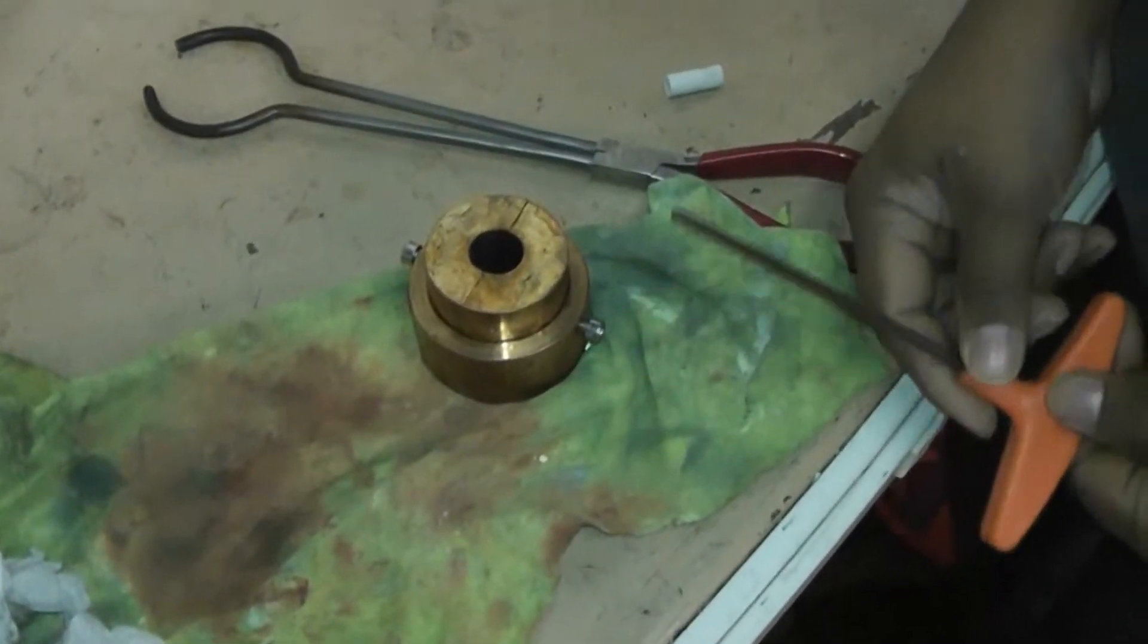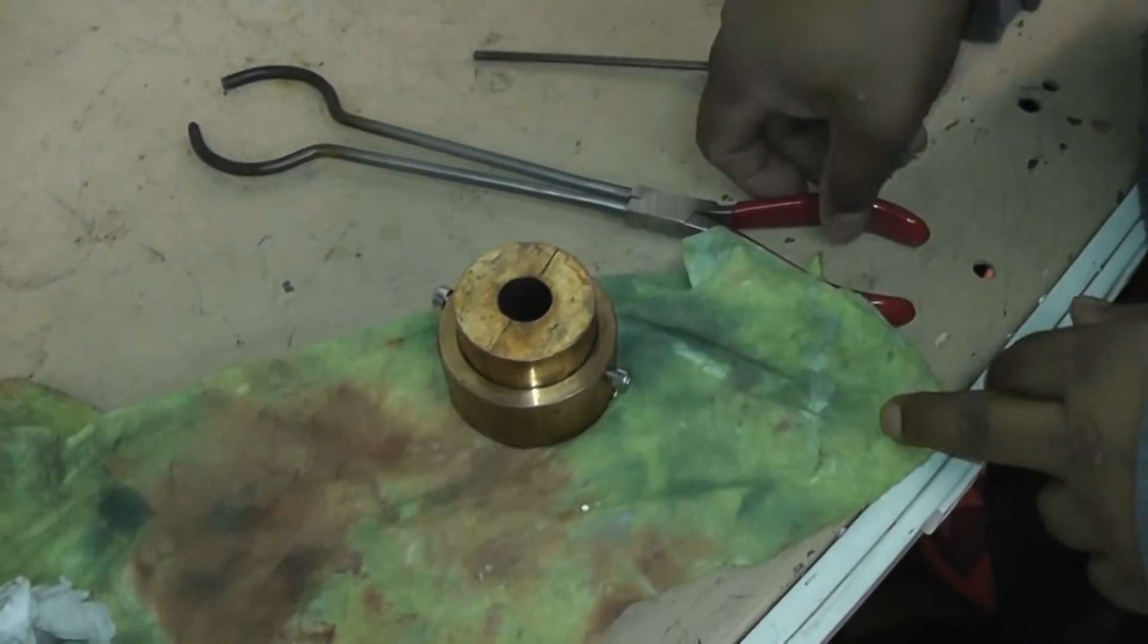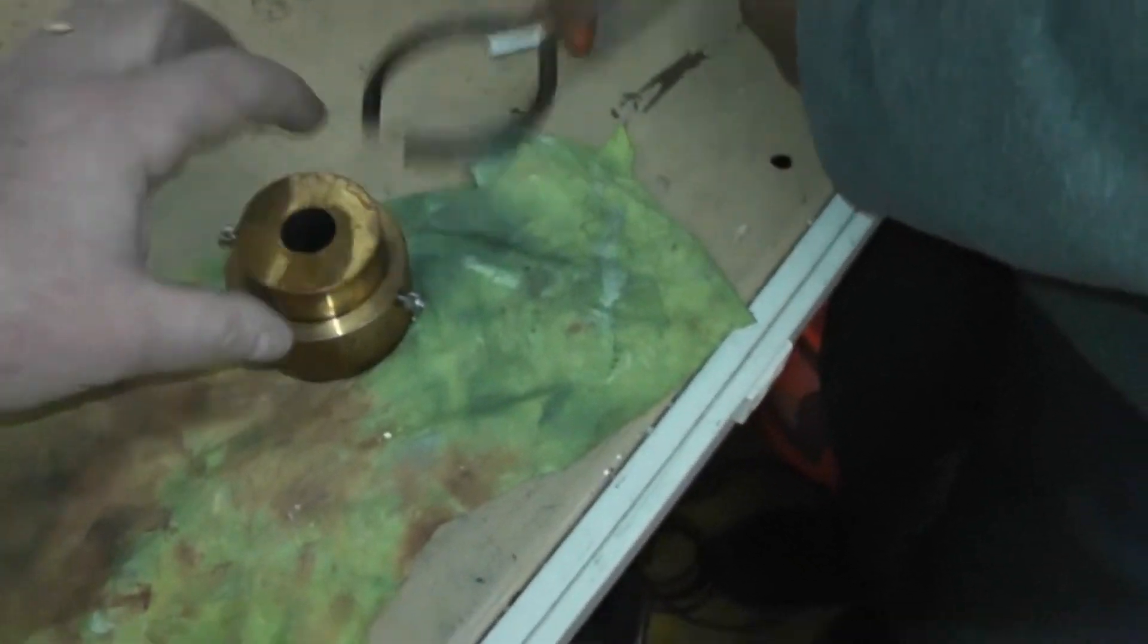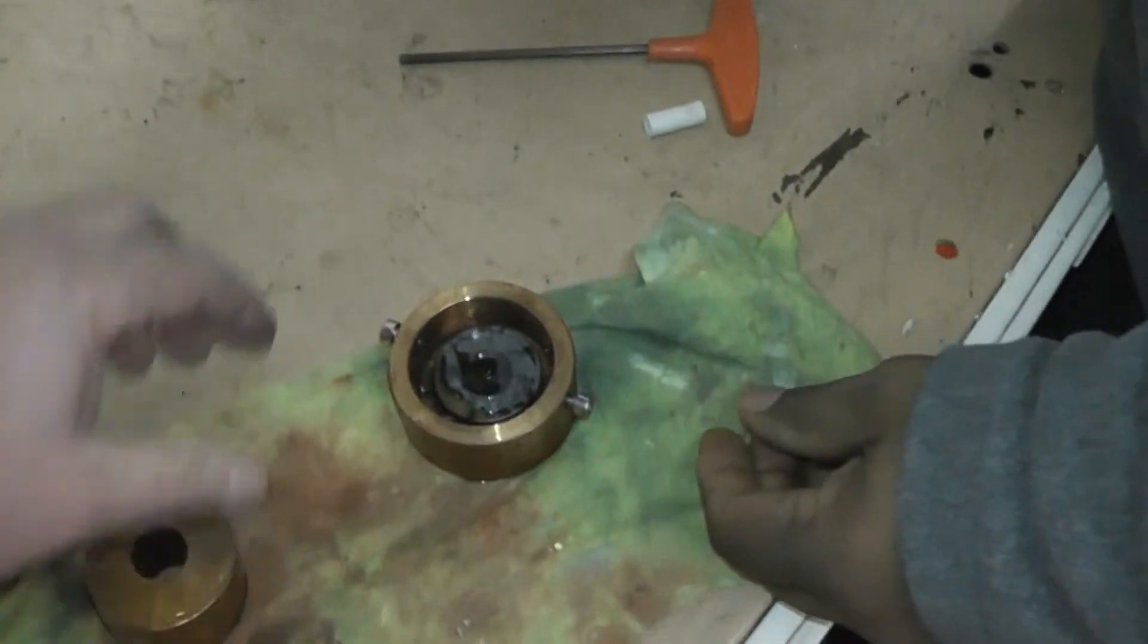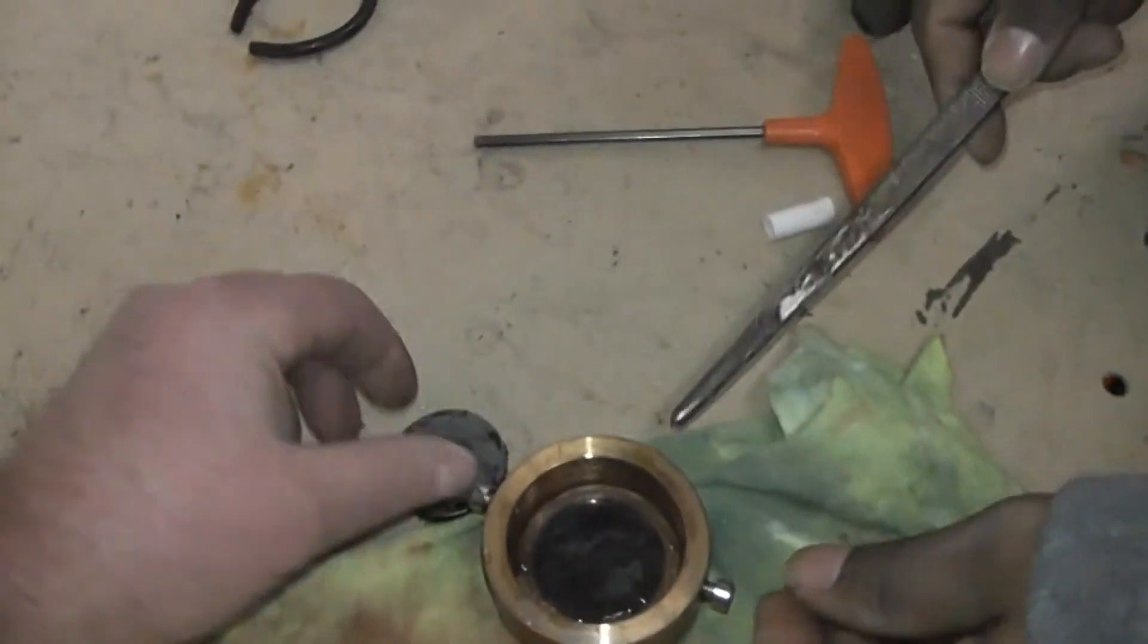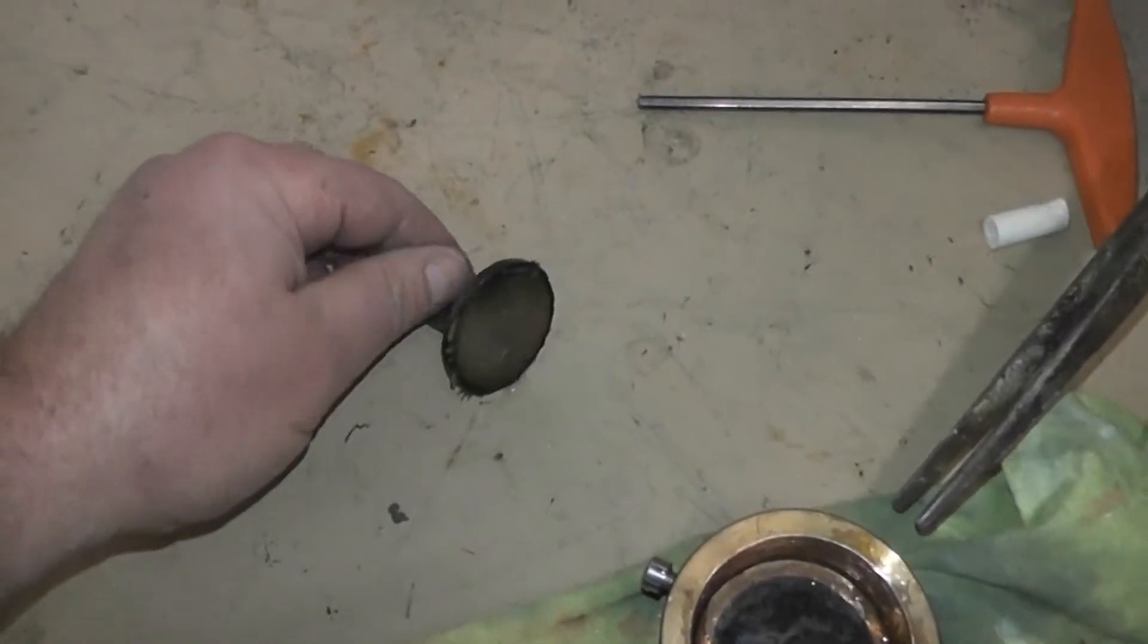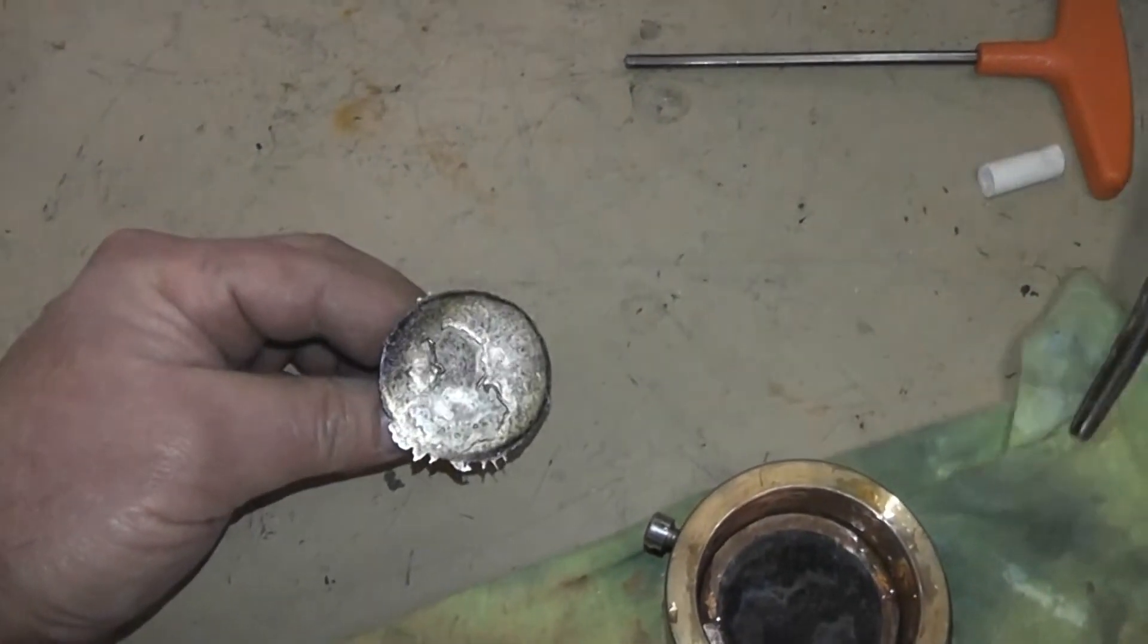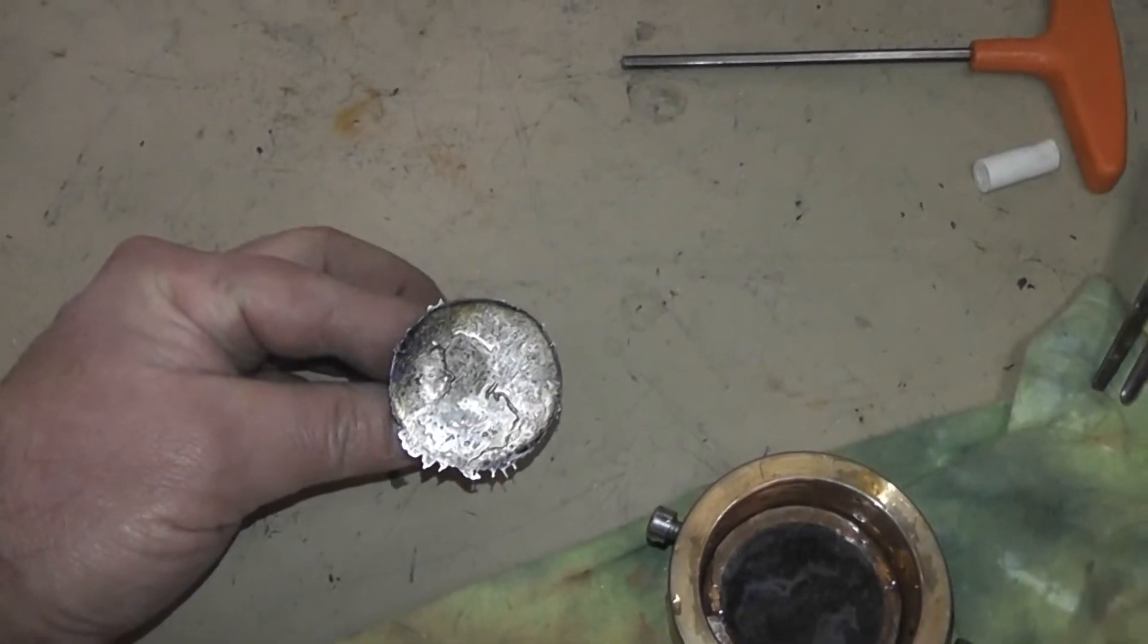Now we are going to open the ingot mold and take a look at the coin that we cast. We have got a nice coin that can now be surfaced and analyzed on a spectrometer.